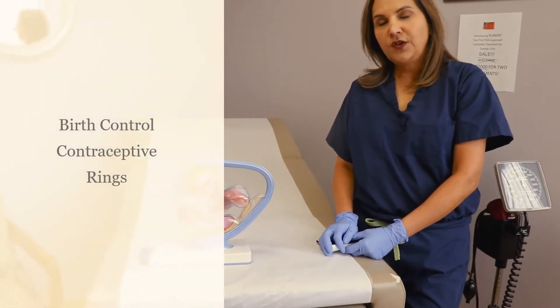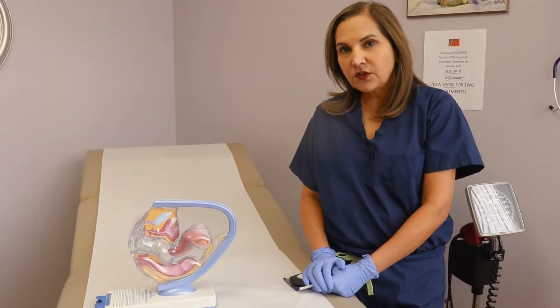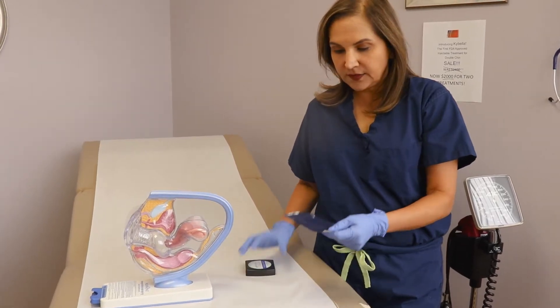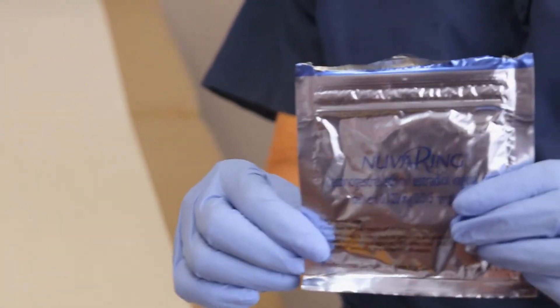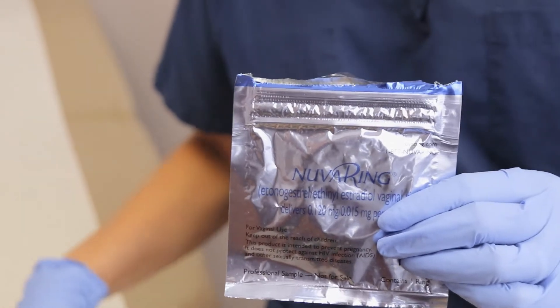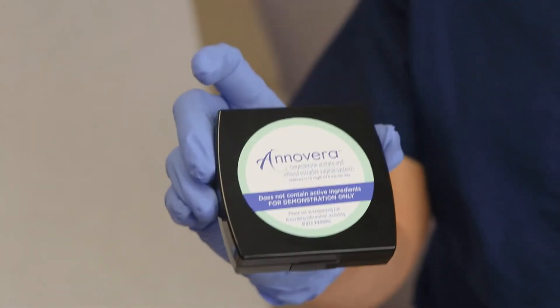Hey guys, I wanted to talk to you today about birth control contraceptive rings. There are two rings on the market. One is called NuvaRing — this is the packaging of the NuvaRing — and it's a disposable ring for monthly use. The newer one, which just came on the market, is called Anovera, and it's one ring you can use for the entire year.